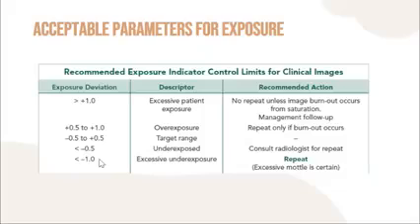If it is below 50, which is half of 100, the underexposure is excessive. Check whether to repeat an underexposed image, since quantum mottle is apparent; you have to consult the radiologist for the repeat, whether he can read it or not. If he cannot read it, you have to repeat. For excessive underexposure, since mottle is certain, you will really have to repeat this procedure.